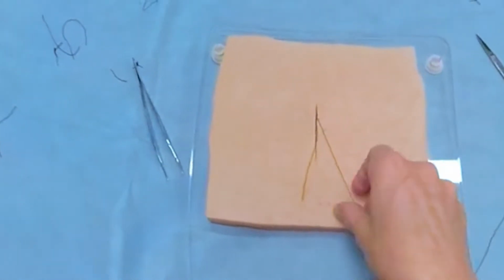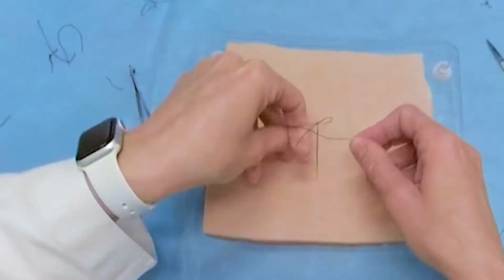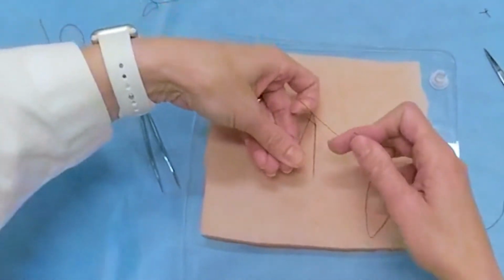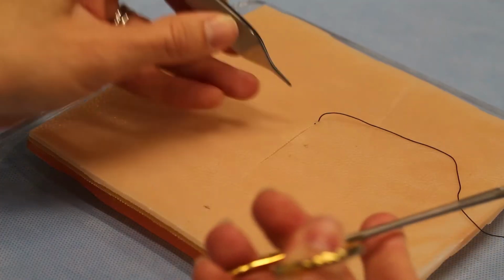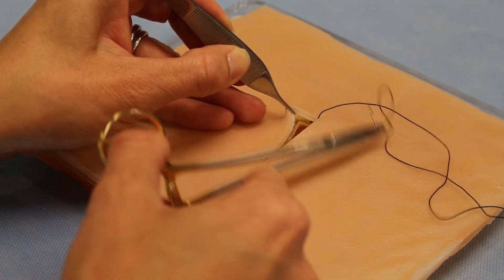So this is the same as what we just did, and you're going to tie a knot. Now if you were doing an interrupted, you would cut both of these sutures off. But since we're not doing an interrupted, we want to leave the needle end intact. So we're just going to cut the end without the needle. Now that we've buried that knot, our knot is deep, which means that this suture is coming from deep.